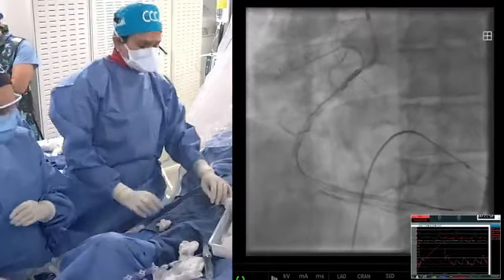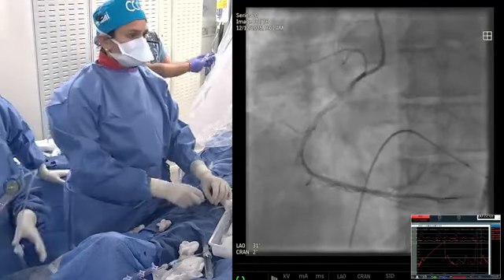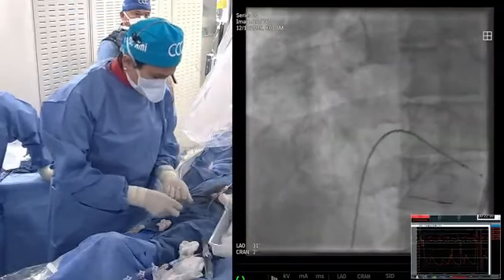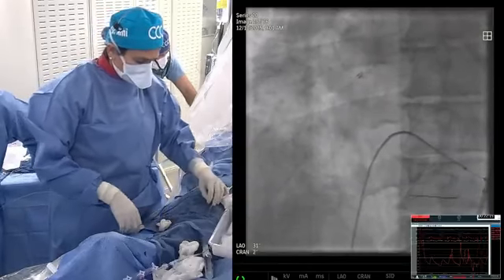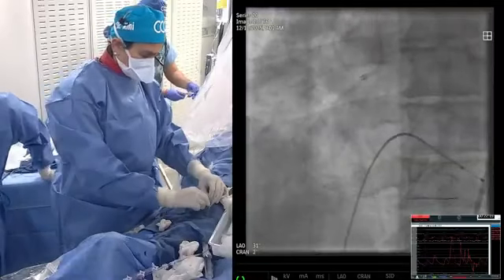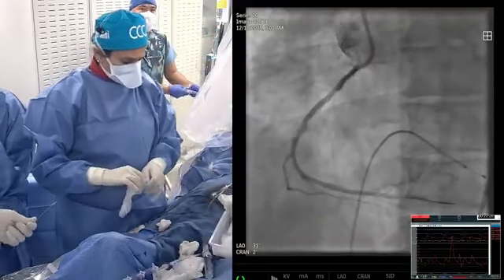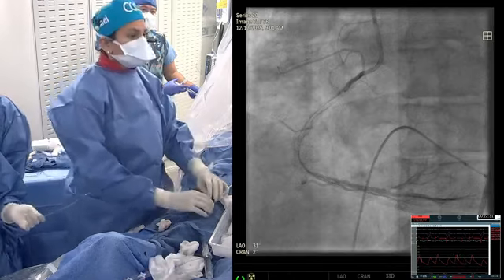RV branch. Looks good. The only question is what we need at this time: AI incorporated in the imaging. You have done this, you want to do IVUS or OCT and have it tell us you are done with the plaque modification, put a stent. We don't have that AI technology yet. Even the number of fractures and this and that is all hypothetical. Here looks okay.